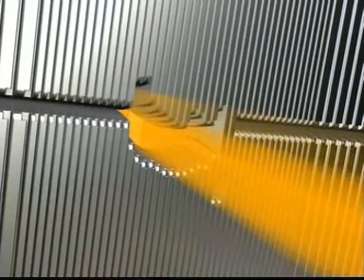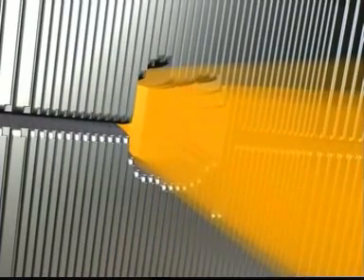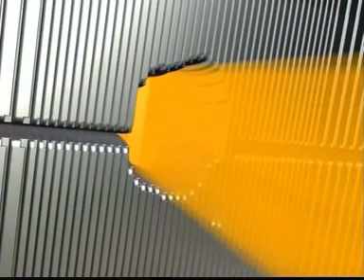The delivery is fully dynamic, using the sliding window technique, where each pair of leaves form a small moving window. This way, the dose is modulated by the size and speed of these windows.